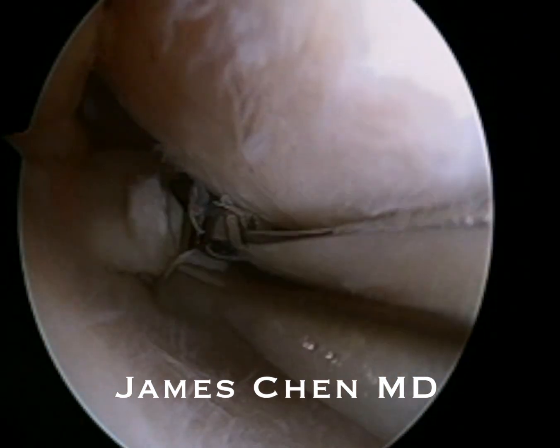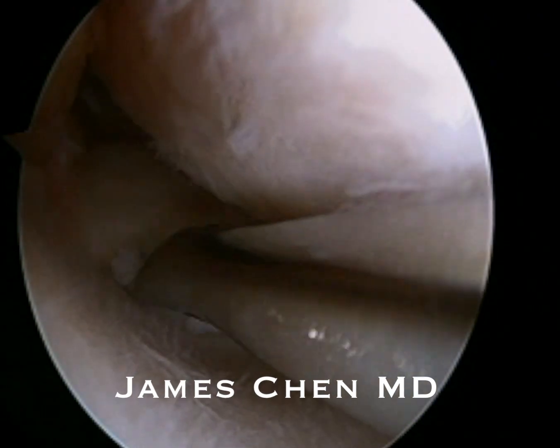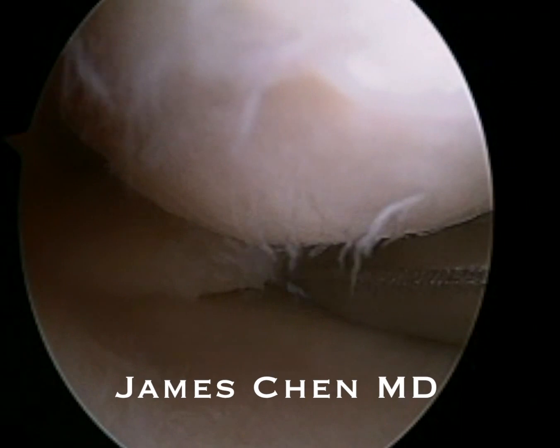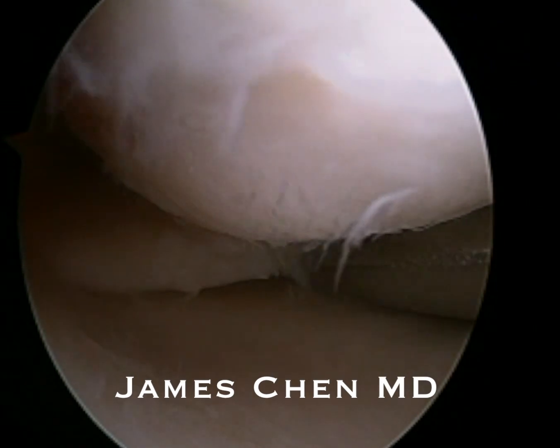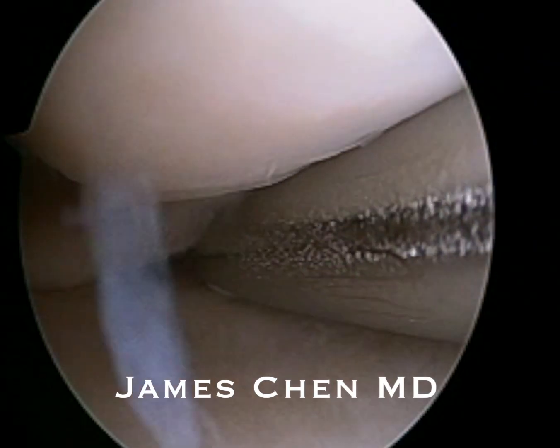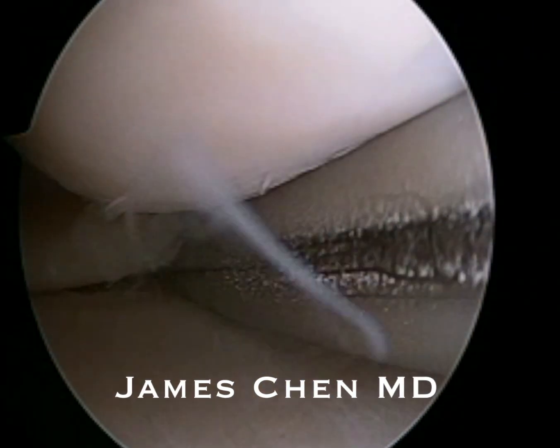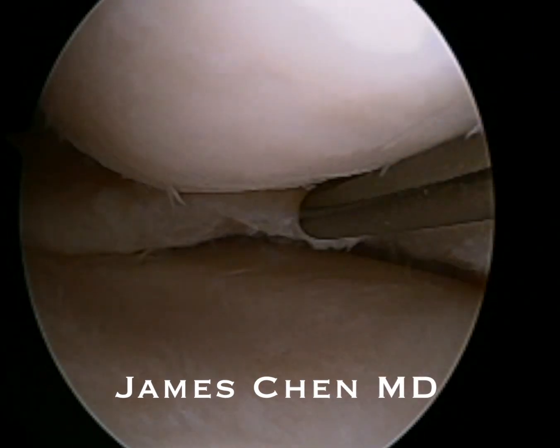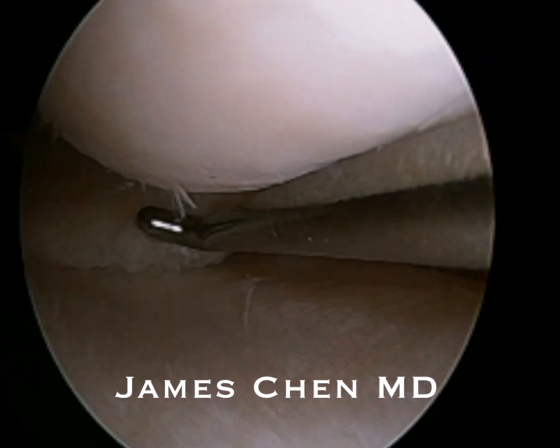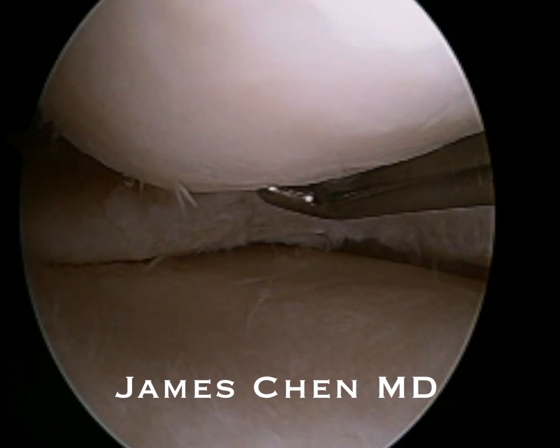I use the biter one more time and the shaver one more time. Then I am probing the meniscus. You can see I have left the top leaf of the meniscus and removed the flapping component.